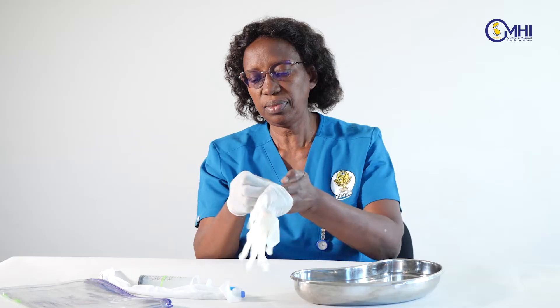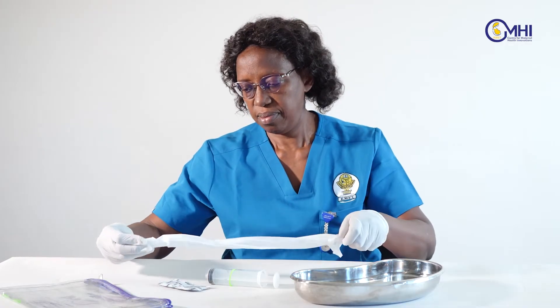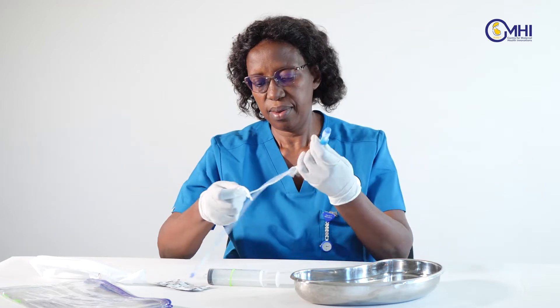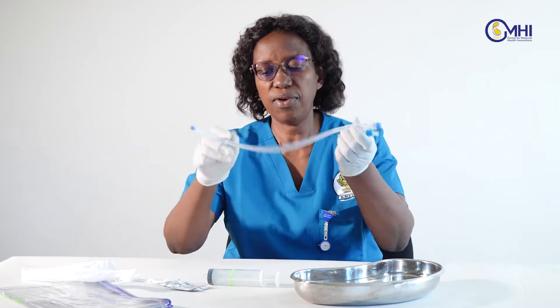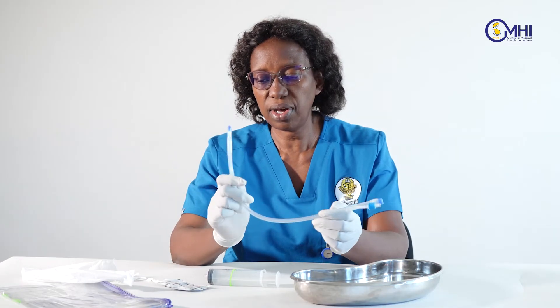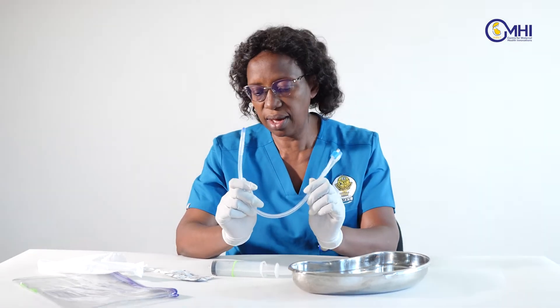First, put on your gloves or change your gloves depending on what you are doing. Then pull out the catheter. Our foley catheter is silicone because of the flow of blood we are going against — we need a stiff catheter, which is why we are using a silicone catheter.